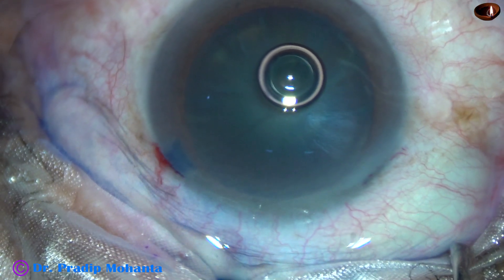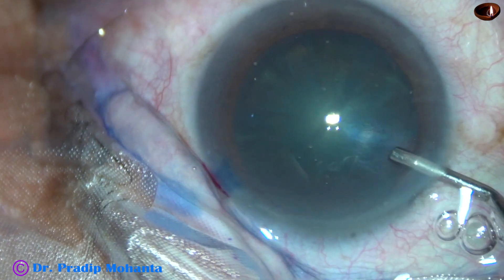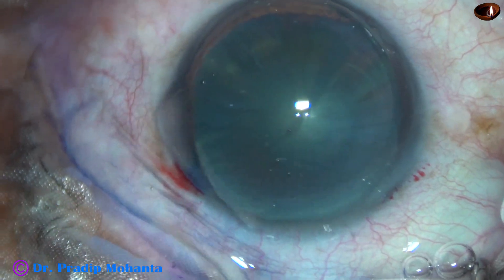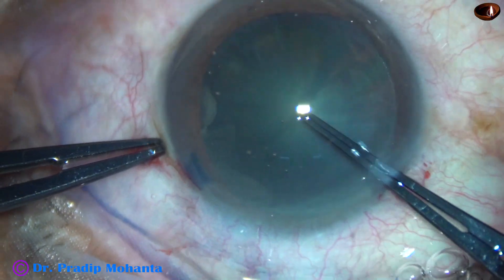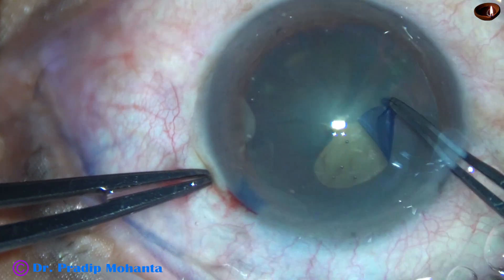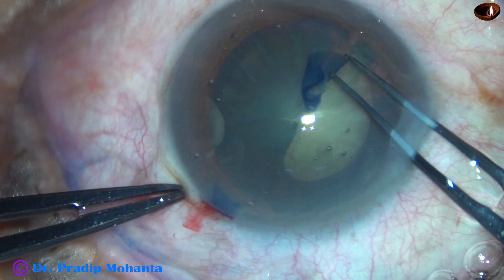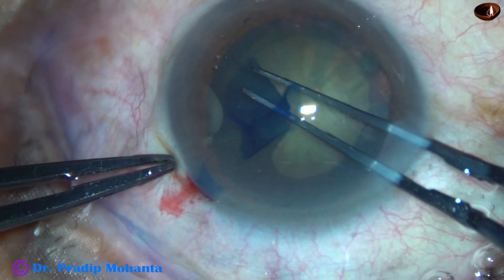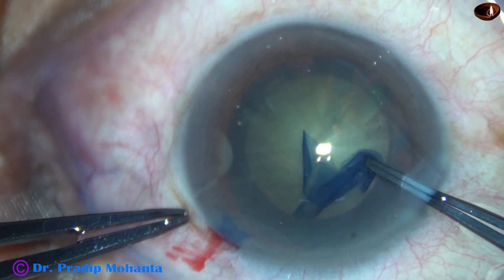The anterior chamber is then filled up with 2% hydroxypropylmethylcellulose, and it is applied over the corneal epithelium for better visibility. And now capsulorrhexis — the utrata forceps pierces the anterior capsule and raises a capsular tag. This capsular tag is guided anti-clockwise in such a way that we get an adequate sized rhexis of about 5 to 5.5 mm. So this is a very satisfactory rhexis.